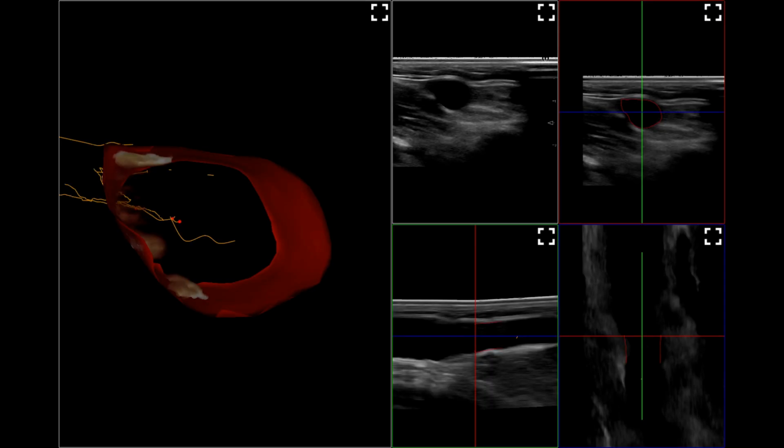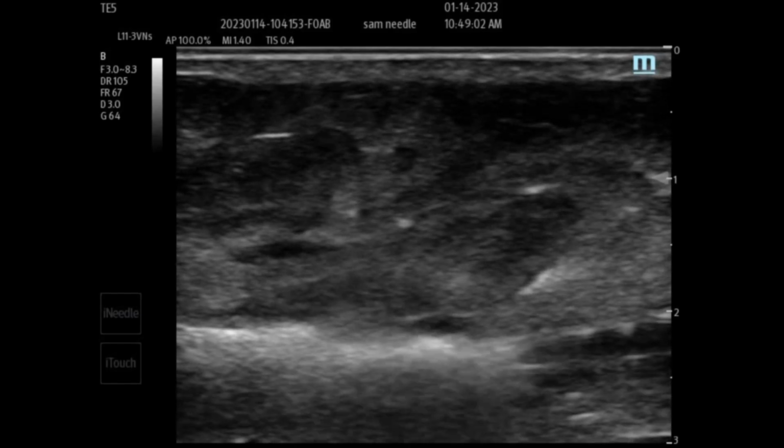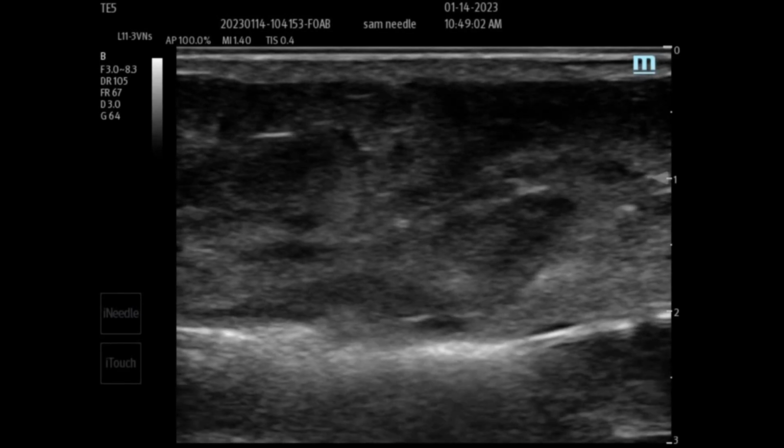When the laser is fired, both hemoglobin and water in this blood absorb energy, about 15% from hemoglobin and over 60% from water, generating enough heat to cause irreversible thermal damage to the vein wall. Now, let's talk about the benefits of using longer wavelengths like 1940 nanometers. While they don't dramatically increase direct wall absorption, they do have some clear advantages: less pain after the procedure, less bruising, and a lower risk of thrombus formation.